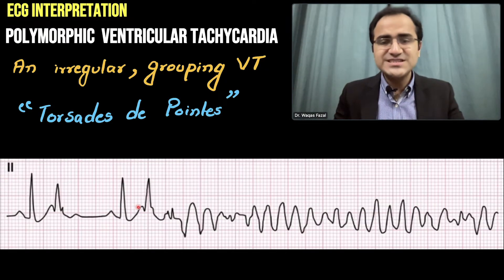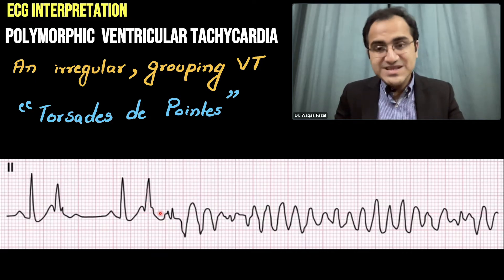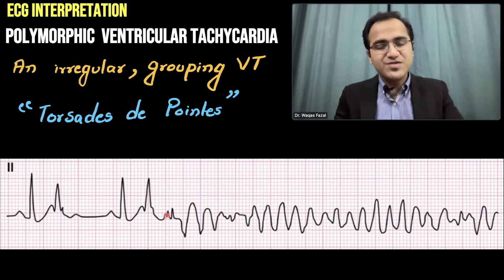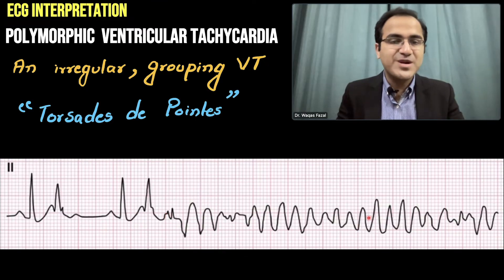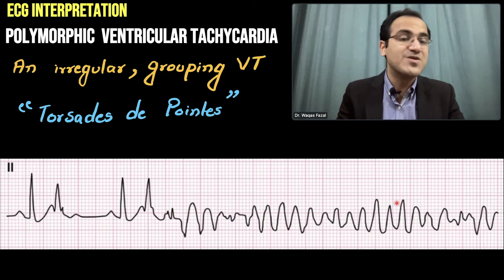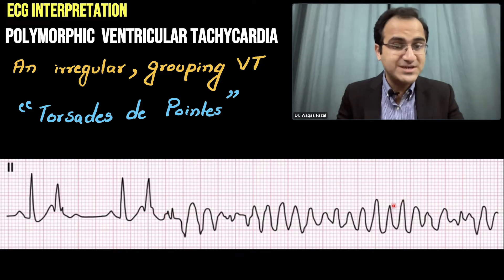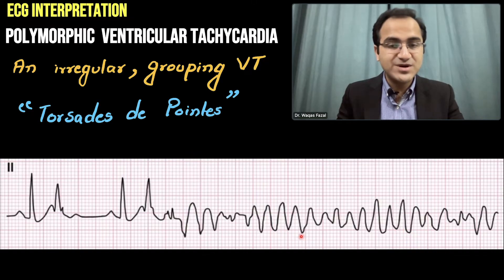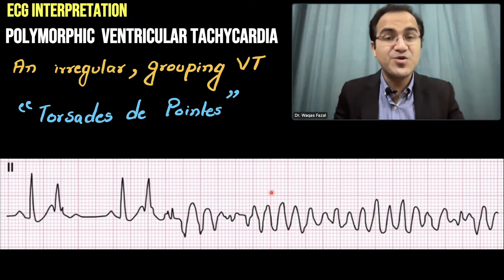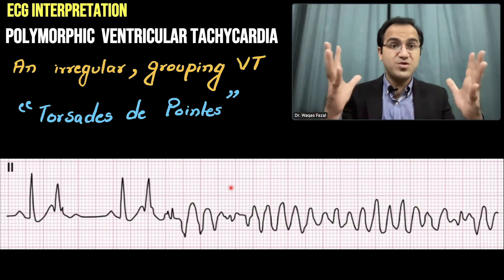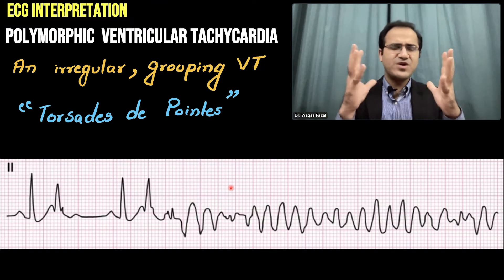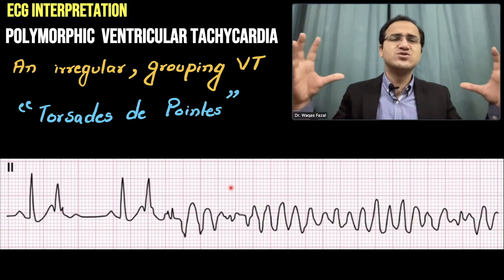Looking at this ECG, the patient was already not in a normal rhythm and then developed a polymorphic ventricular tachycardia. This is the polymorphic ventricular tachycardia — the twisting around the points. These are the pointed ends, these are the round waves, these are the points again, and these are the round parts. This is called twisting of the points — torsades de pointes — with multiple foci beating simultaneously, jumbling together to form this polymorphic ventricular tachycardia.